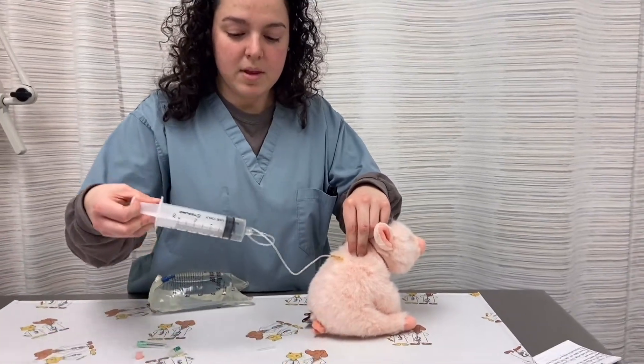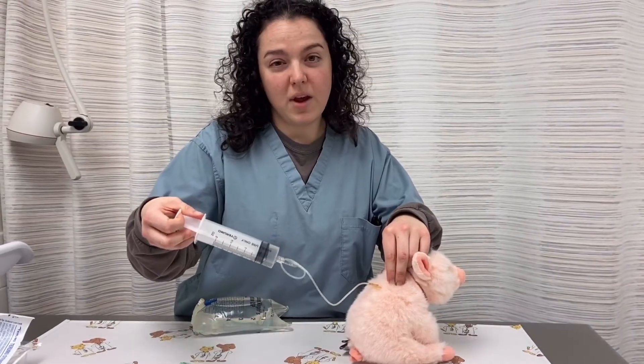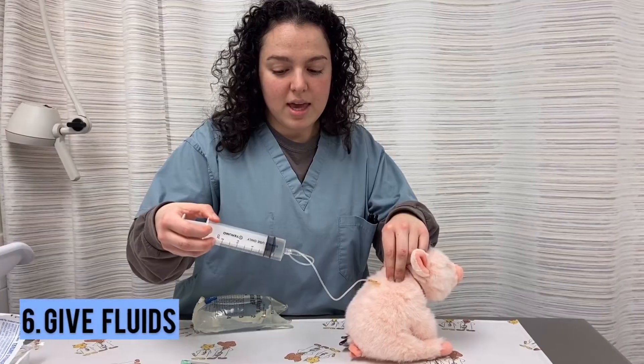Once it's securely in, pull back on the plunger a little bit to make sure there's no blood. If a little bit of air or a negative pressure is seen, that is okay. Gently give the fluids.